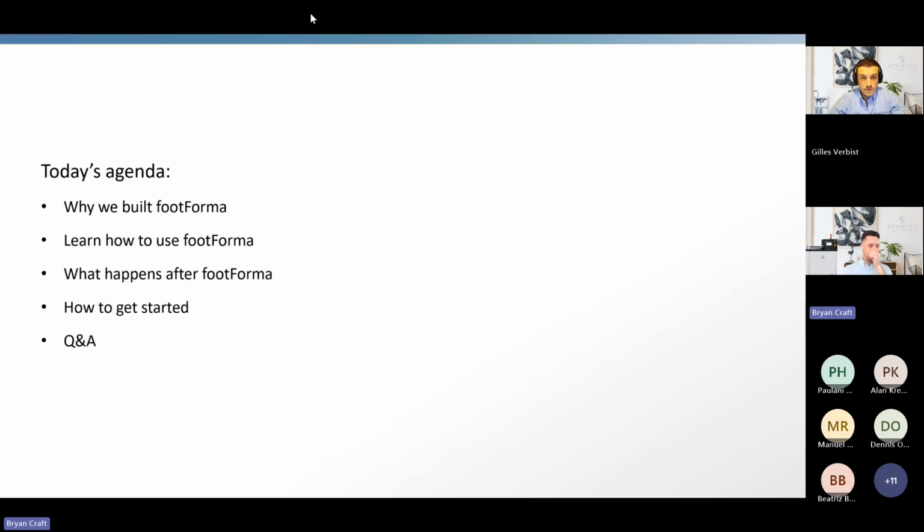So today, we're going to have a conversation about footForma. We hope that by the end of this webinar, you are downloading and installing the footForma application so that you could be able to take what you learn in this webinar and apply it immediately. You'll see by the end of it, we have a very simple pathway for you to access this software, and we hope that you will join us in using it.